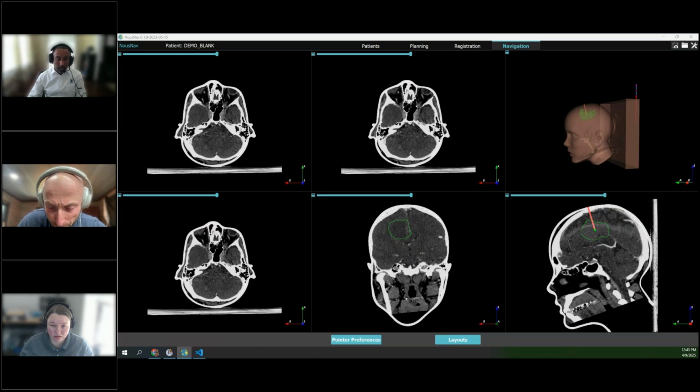And so let's see. I think the reslice driver question is a bit more technical than we can get into here. Bala, I will send you an email with the details on that, because that's just a bit much to dig into. And then we'll provide at the end resources and how people can reach out to us if they need help on specific questions.